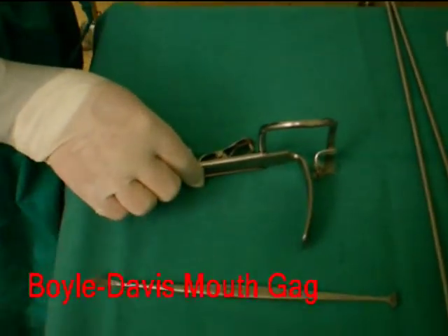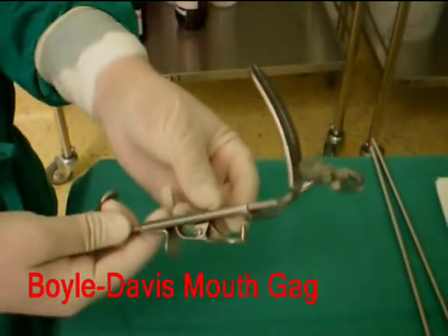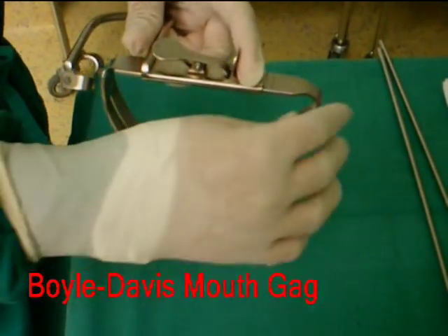To enable visualization during the surgery, a Boyle Davis mouth gag is used. It has an adjustable, retractable blade, as shown.